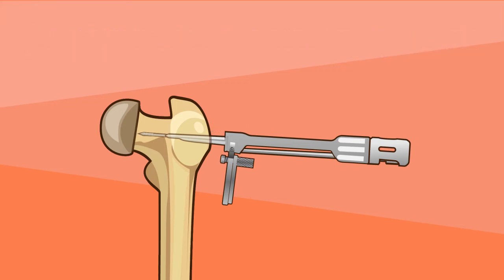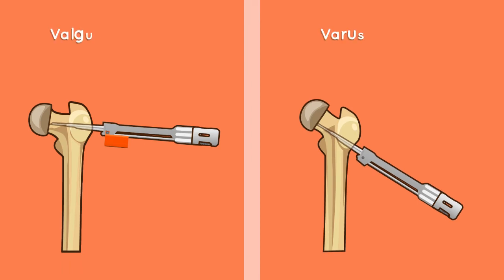The blade will be impacted to its final position after plate assembly. Step 7: osteotomy. Before performing the osteotomy, it is recommended to score the bone above and below the osteotomy level in order to retain a rotational reference.